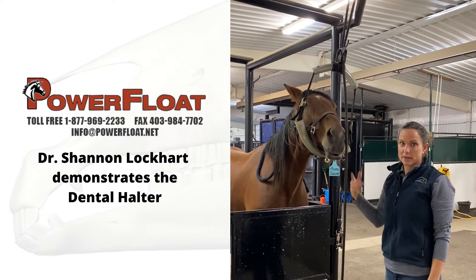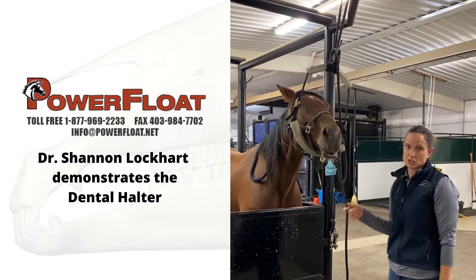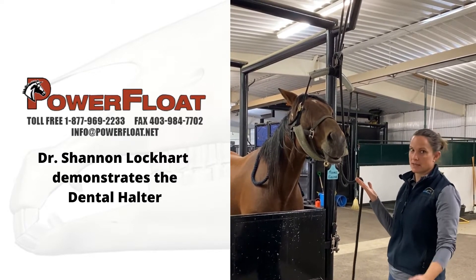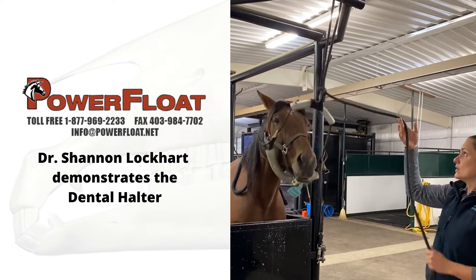Once I get going, I find this rope gets in my way. So all I do is put it through the halter like this. You still want to be able to grab this — so if something happens and the horse reacts to something and you want to avoid a wreck, all you need to do is pull your rope to undo the cleat.